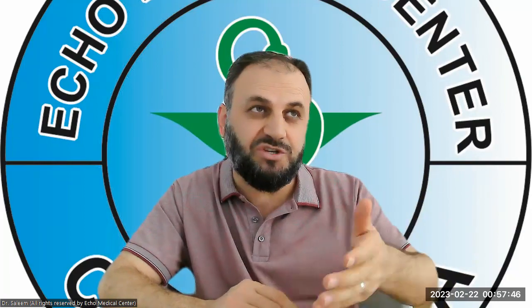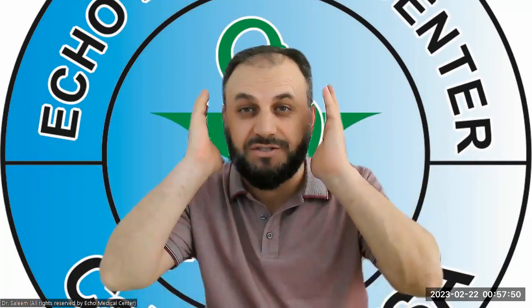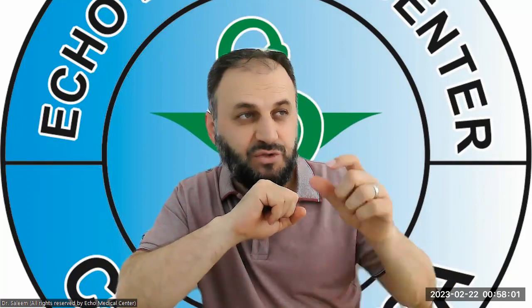Now jump to the ICA, internal carotid artery, which is the main focus area of our study, because that is the artery that gives 75 to 80% of the anterior circulation to the brain. That's where the blood goes. Now I will take prox, mid, and distal ICA to make sure that the brain is getting enough blood.